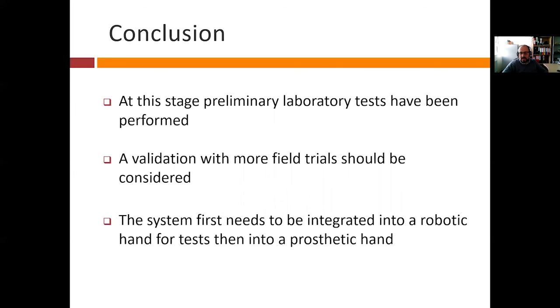But the type of application we can think about can be different. For example, we had already looked a little bit at how to use this kind of technology for sign language recognition. So you can start to think about an interface where someone is talking to you through some sign language, and then you can translate this information into whatever you want. So you can write this information or you can vocalize this information.